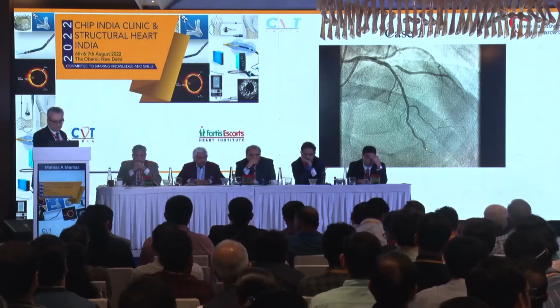Here's another case. Now, you may say, well, why are you showing us this case? This is a really simple ostial lesion. This is a case of a patient who came in with an acute coronary syndrome. Many will say, this is not complex. I'm going to show you some data to actually show this sort of case has the worst outcomes of all bifurcation lesions. So the 001 cases have by far the worst outcomes.